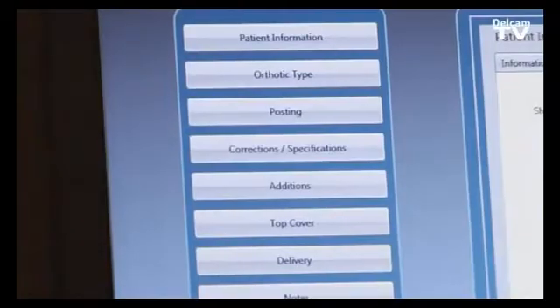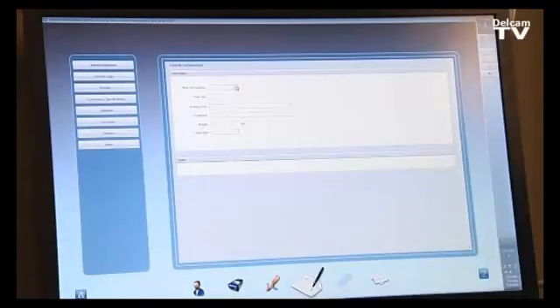On the left-hand side, we have all the options we can select — for example, the shoe grading, such as U.S. men's number 9, the activity level from 1 to 4, and the material type: rigid, semi-flexible, and flexible.